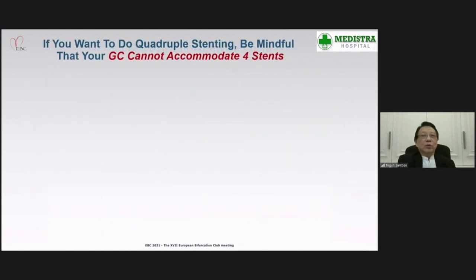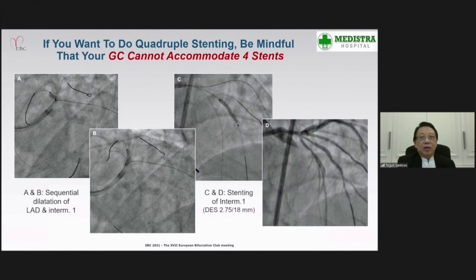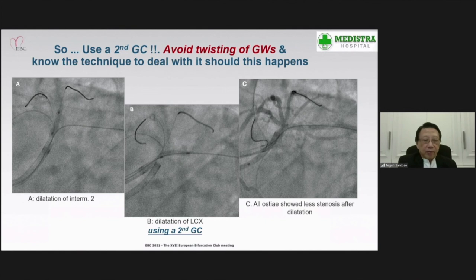So if we want to do quadruple stenting, we have to be mindful that our guiding catheter cannot accommodate all stents. So initially, we opened up the stenosis in the LAD ostium because flow in the LAD was sluggish, followed by opening the first intermediate branch ostium, followed by stenting of that vessel, and then we have to use two guiding catheters. We have to avoid twisting of the guide wires, and we should know the technique to deal with it should this happen.